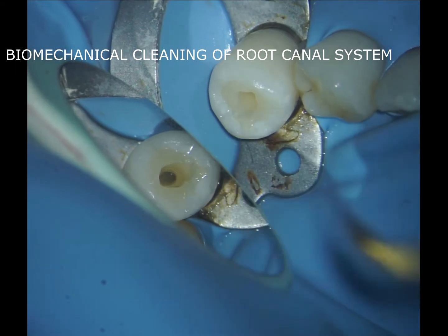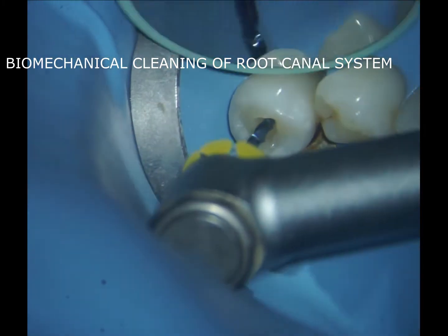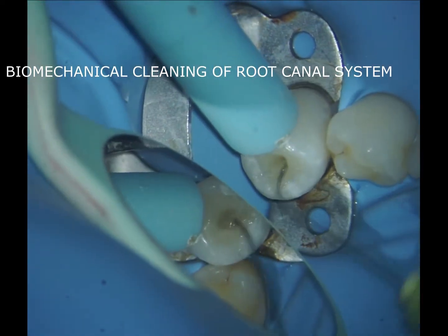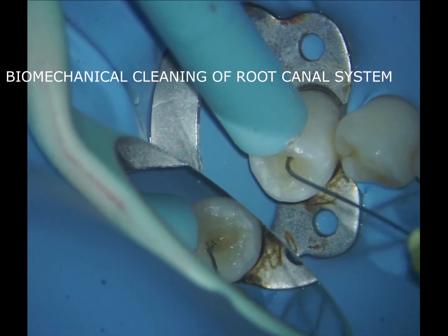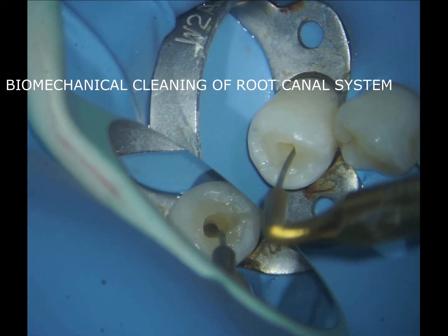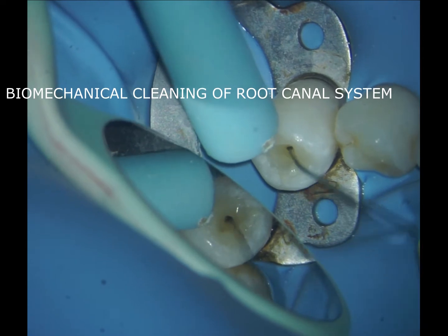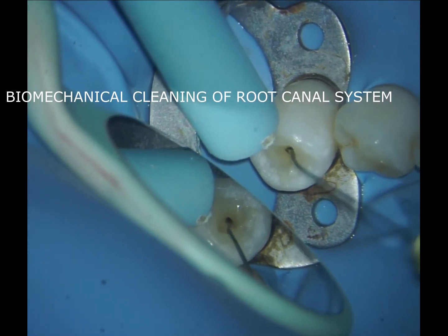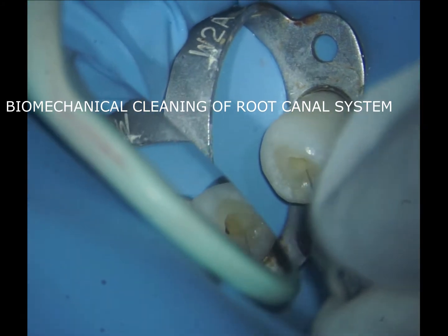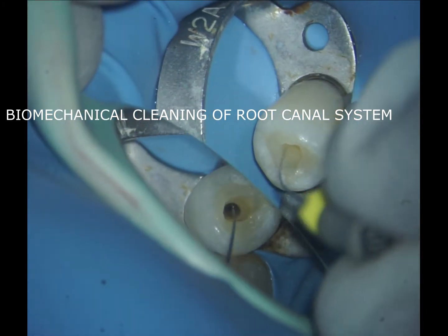Before taking the working length, as we do in a crown-down technique, I am using the first orifice opener and glide path up to two-thirds of the working length — approximately 16 to 17 millimeters — without pushing the file, just debriding the coronal root canal system with lots of sodium hypochlorite followed by ultrasonic activation. Remember: in a non-vital root canal system, the more coronal debris you debride before touching the apical third, the fewer flare-ups you'll face.